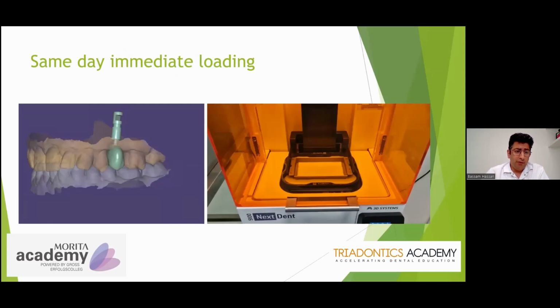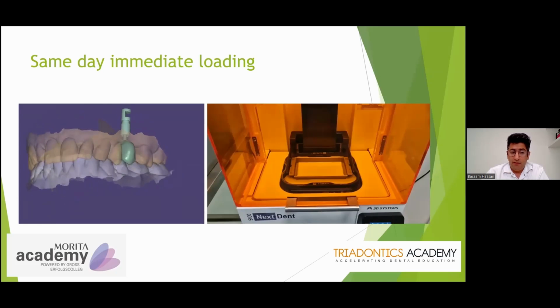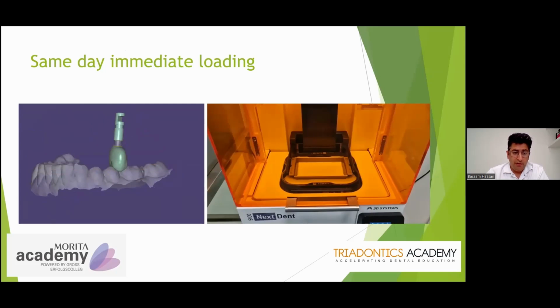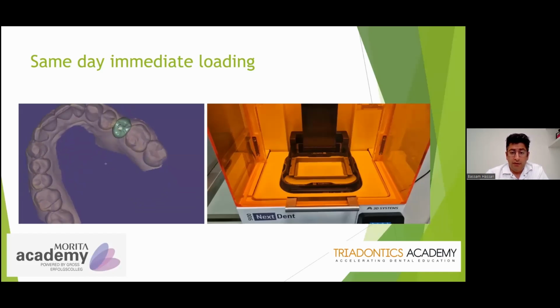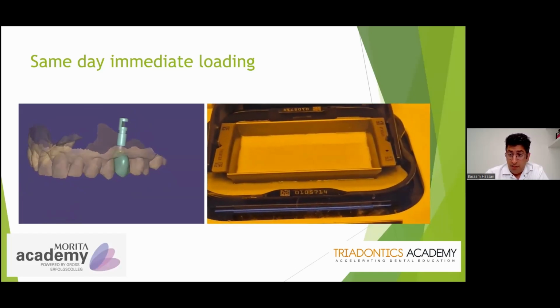When we went to implants, the first thing that we could conquer was the same day immediate loading, or same day single implant cases, in which you do have many teeth references, and then you could scan quite easily. You have neighboring teeth, only a single gap, only one implant. You can design it, then 3D print a temporary crown. This is nothing new. This has basically been going on for, I think, 5-6 years already. I think temporary crown restorations appeared in 2019, if I'm not mistaken.